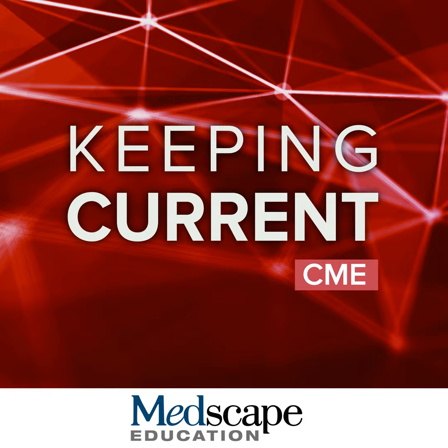Another way we use gadaxetate in patients who don't have parenchymal liver disease is detection of metastases. Consider these two patients. Both of them had a history of neuroendocrine primary tumors, which means that we expect a hypervascular pattern of metastatic disease to the liver. And notice that we have these two lesions. Both of them are hyperenhancing on arterial phase and become iso to slightly hypoenhancing on portal venous phase. So are these hypervascular neuroendocrine tumor metastases?